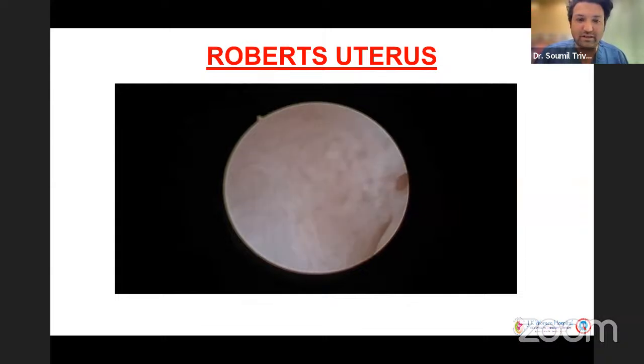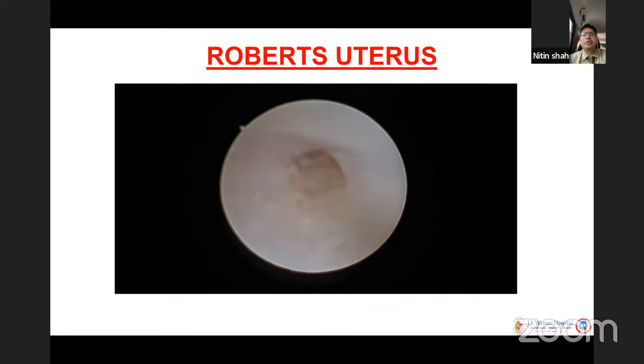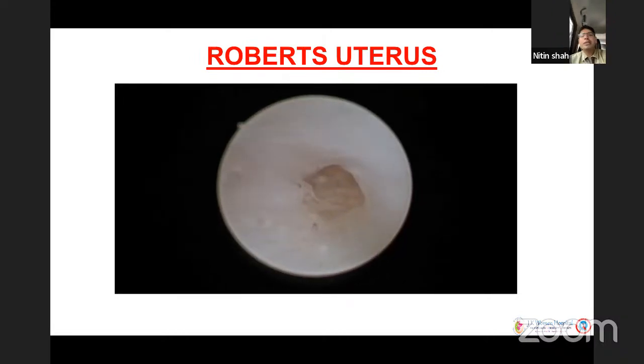Start from the lower base, go towards the internal cervical os, and then you start cutting on the side where you suspect. You can also do a trans-illumination and evaluate.